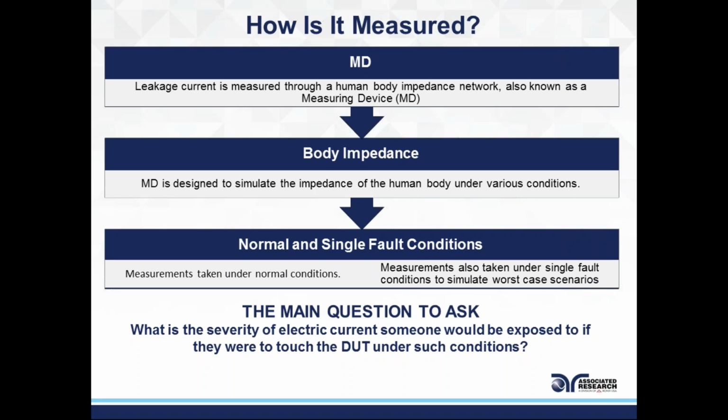So when a hospital doesn't get clean power, are you simulating the proper frequency range? The frequency might be 50 hertz, but there may also be other aspects of the frequency in the line power. If you have dirty power coming out of the wall socket at a hospital and you plug your medical device in, are you able to simulate this properly, where a human body coming in contact lets you measure the correct leakage current?